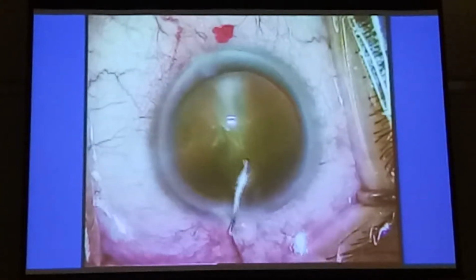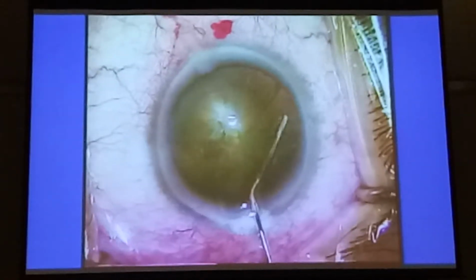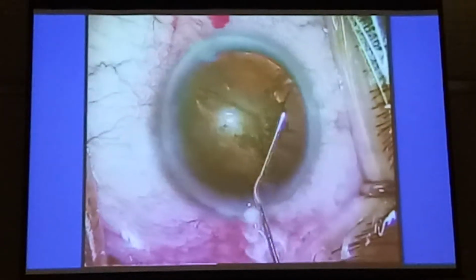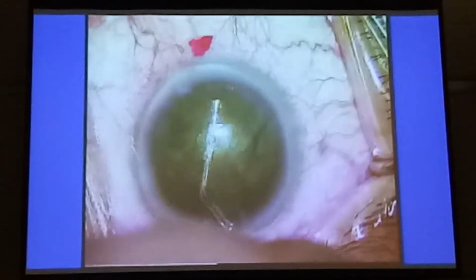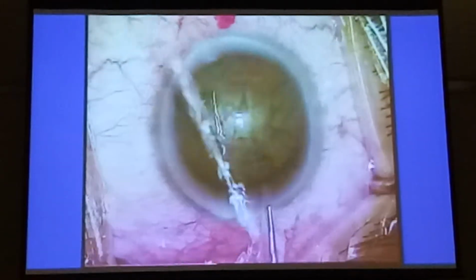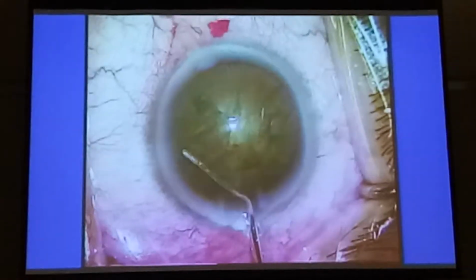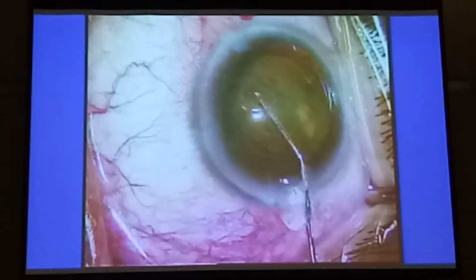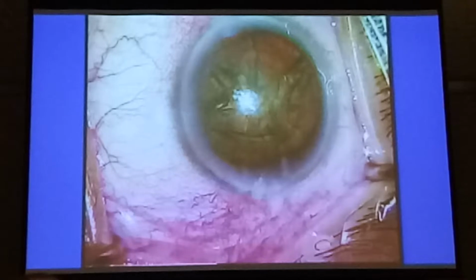Just look at this very quickly. You see all 5 signs here. Let's see whether you all can spot it. Okay, start. Wave, lift, split. See that? In 1 second. Push back. There's the push back. Okay, let's do it on the other side. That's the nucleus prolapse. Convinced? Any arguments? You believe, huh? Okay.